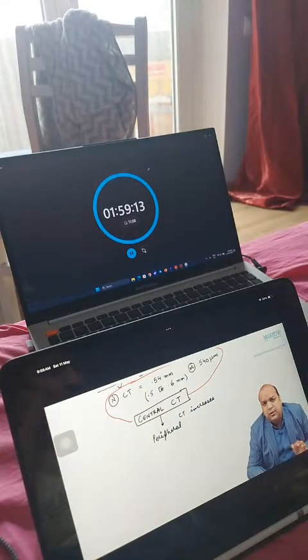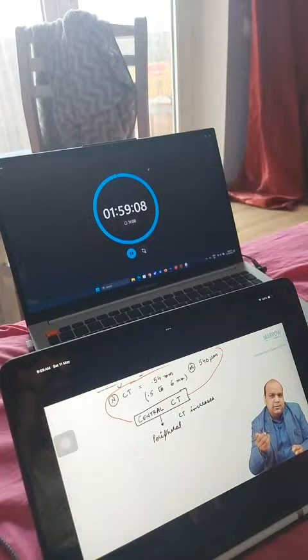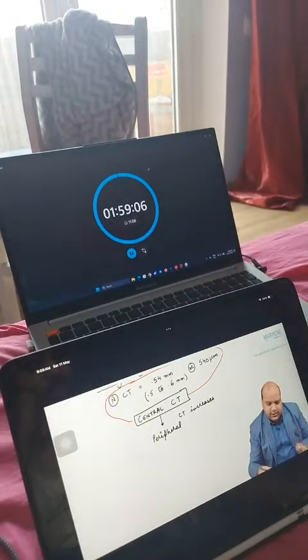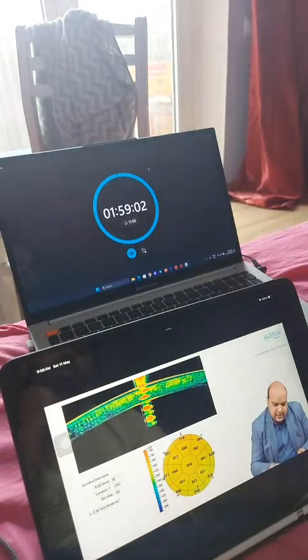Now, how do we measure the corneal thickness? We measure the corneal thickness by a lot of instruments which are just called pachymeters. They can be handheld instruments, they can be cumbersome machines, not going into all that. The end result that we are able to see in almost all the techniques or all the instruments is an image like this.